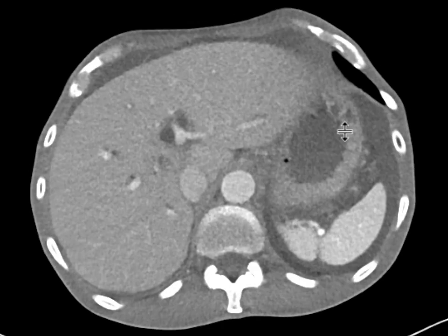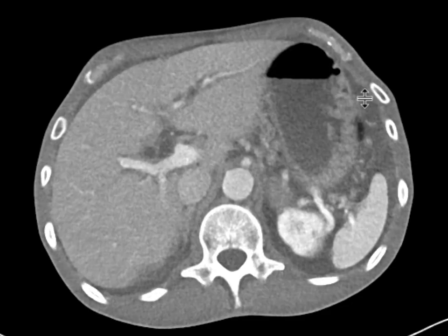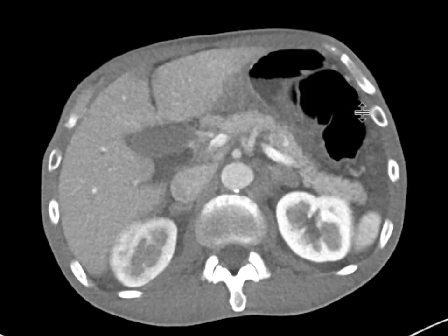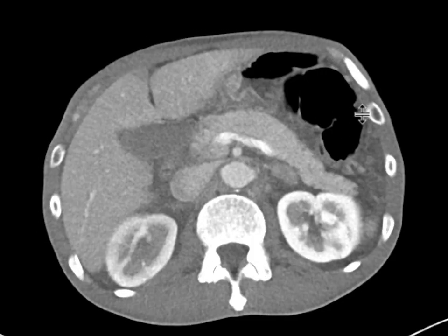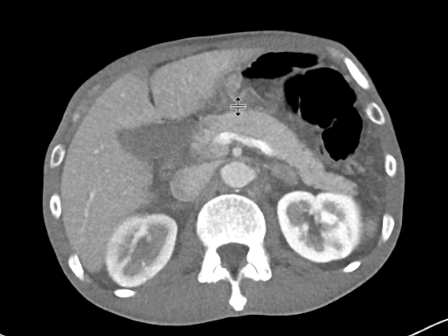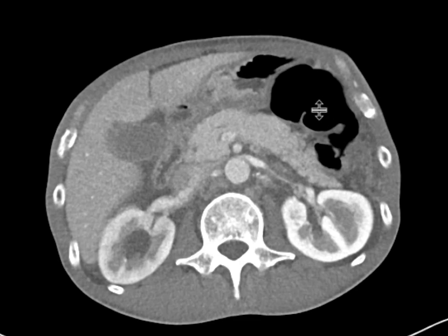The last place to look is the stomach. If we look at the stomach in this instance, the gastric rugal folds in the proximal stomach look pretty unremarkable. As we start to get to the distal stomach — the antrum — look how thick this gastric fold is right over here, compared to some of the other adjacent folds which are much smaller in size. Another feature to notice is that it's quite vascular and has soft tissue attenuation.